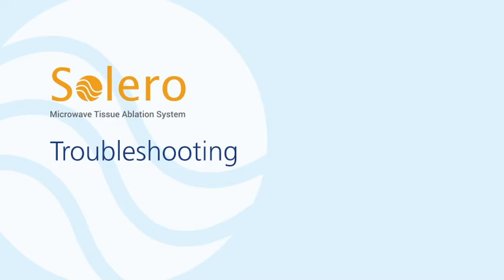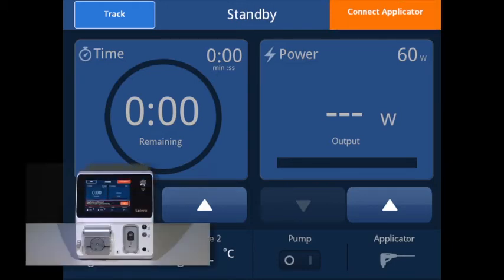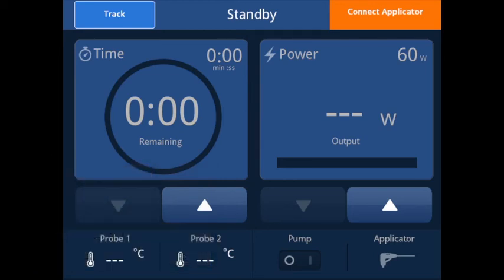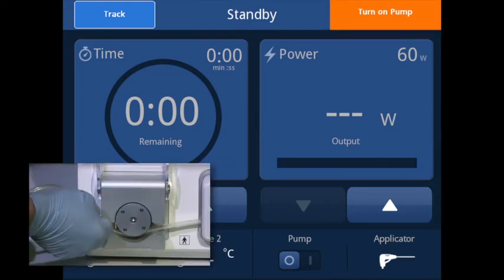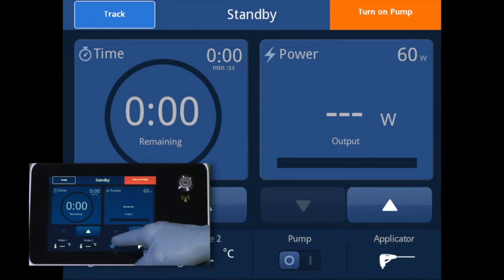Troubleshooting. The connect applicator notification will be displayed when the applicator is not detected. During initial procedure setup, connect the applicator to the front of the generator and the condition will clear automatically. If the applicator is disconnected during use, the microwave delivery will cease until the applicator is reconnected. The turn on pump notification will be displayed when the applicator is connected, the pump housing cover is closed, and the pump is not running properly. Ensure the pump tubing is properly loaded and the pump clip is in place before activating the pump.